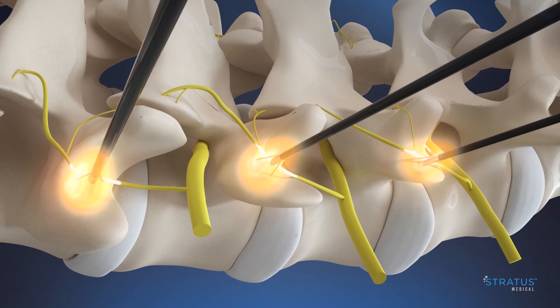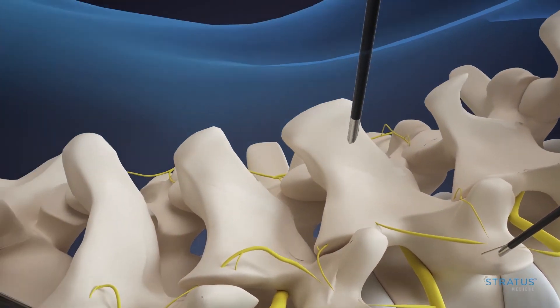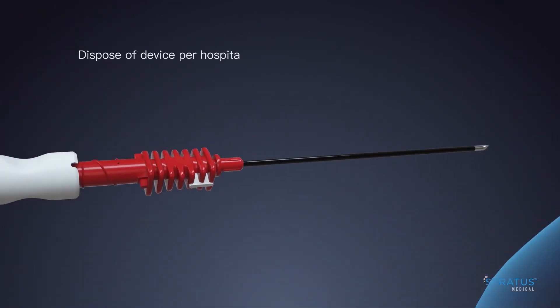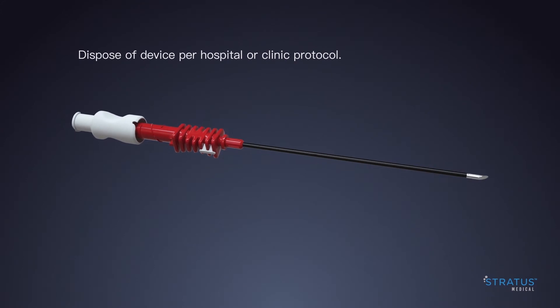When treatment is complete, retract the tines by rotating the spin collar counterclockwise and remove Nimbus from the patient. Nimbus has many compelling clinical and economic advantages versus competing RF technologies. Learn more at stratusmedical.com.